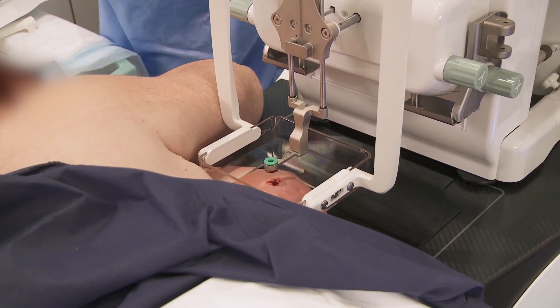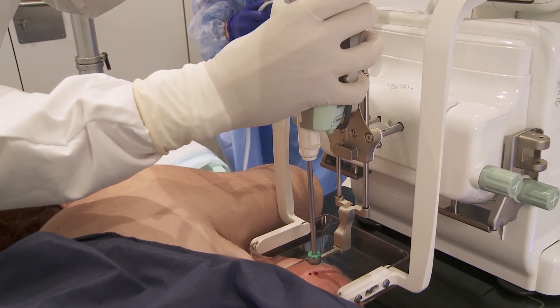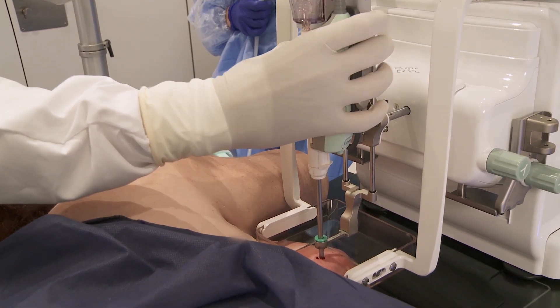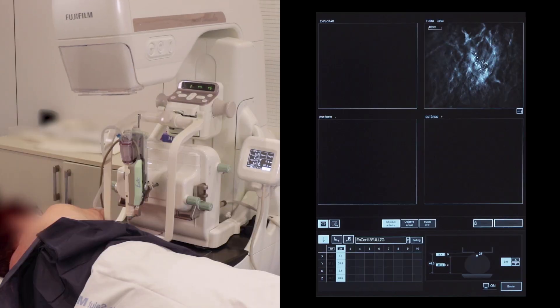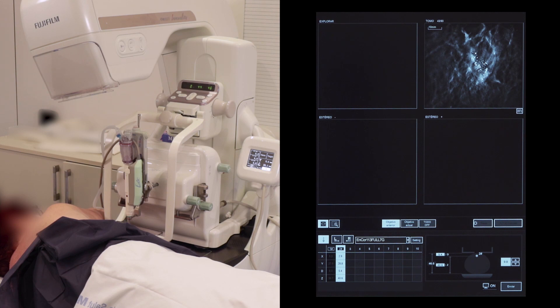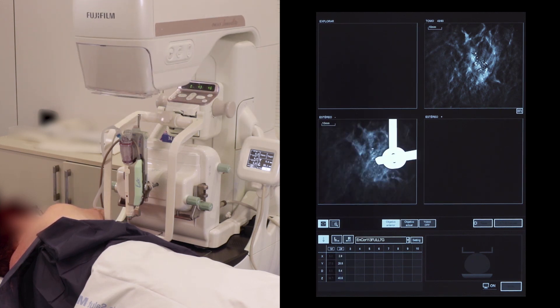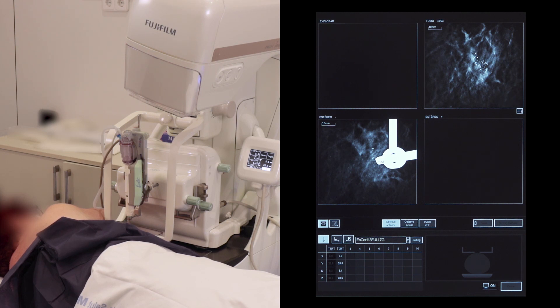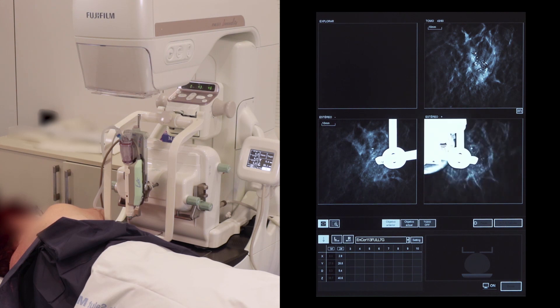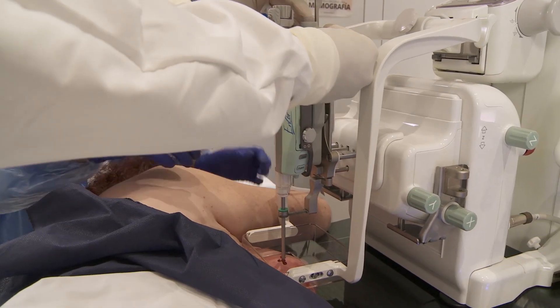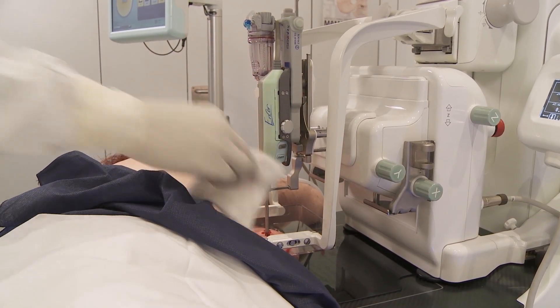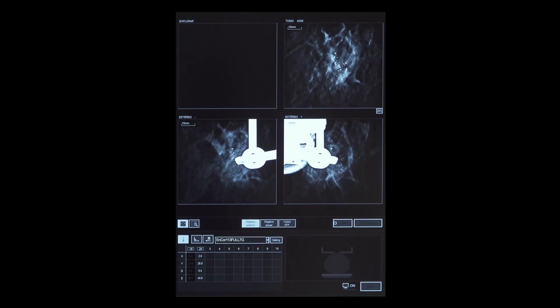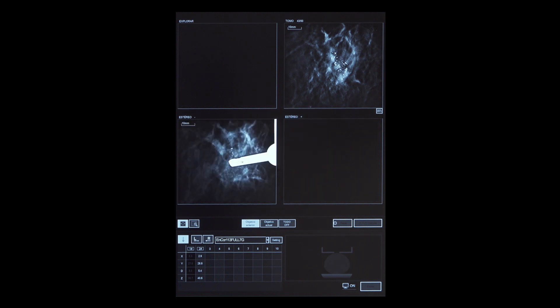Attach the NCORE 7G needle guide. Insert the 7G NCORE probe pre-fire position. A stereo pair is acquired to check needle tip location versus the target. The needle tip is approaching the target. First fire can be completed. A new stereo pair can be acquired to compare pre and post-fire images.